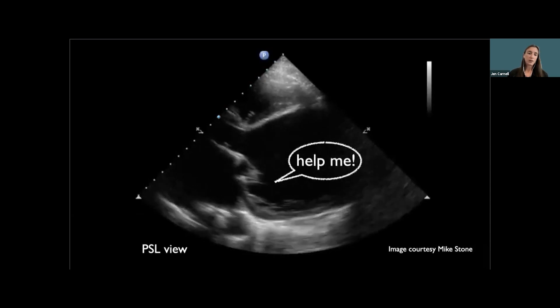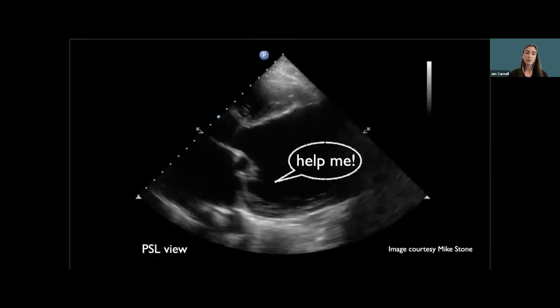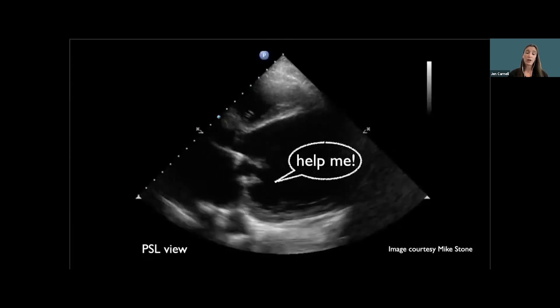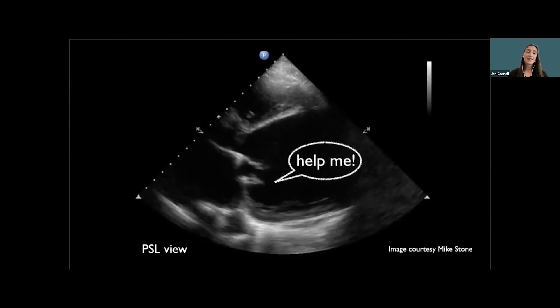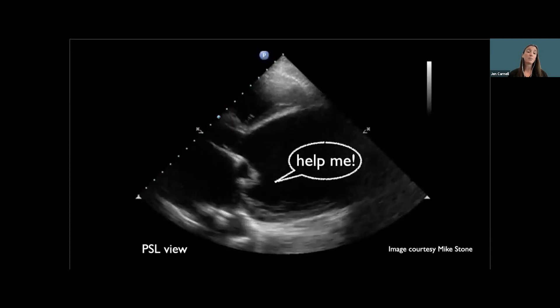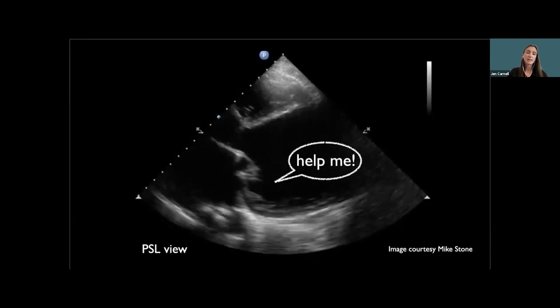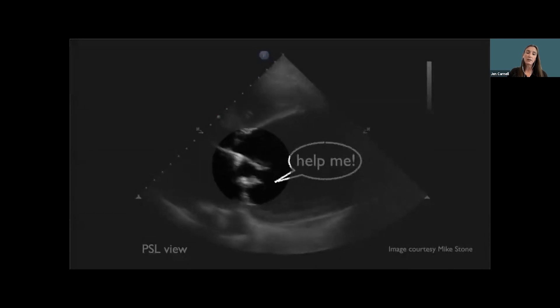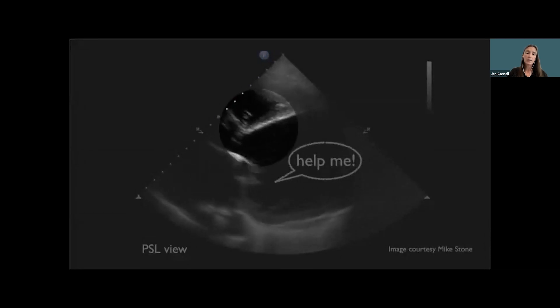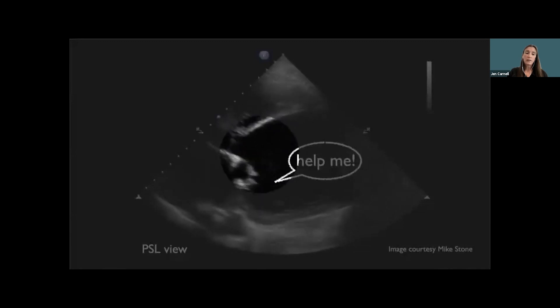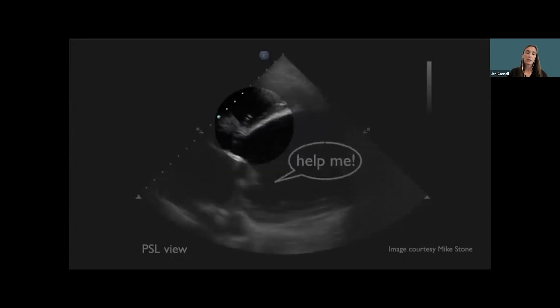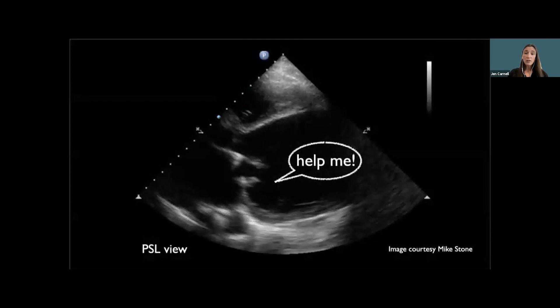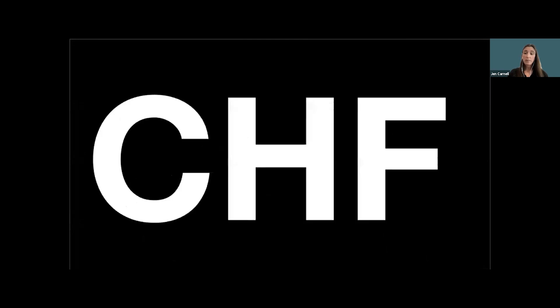Here's a parasternal long view of the heart done with the probe on the left side of the chest, indicator toward the right shoulder. Anytime you can put a giant 'help me' bubble in the middle of the left ventricle, you're in trouble. This left ventricle is totally dilated, the walls barely move toward each other. You can also tell the anterior leaflet of the mitral valve doesn't come anywhere close to the interventricular septum — another sign of heart failure. I'm leaving behind gallbladder pathology and moving toward a new diagnosis of CHF.